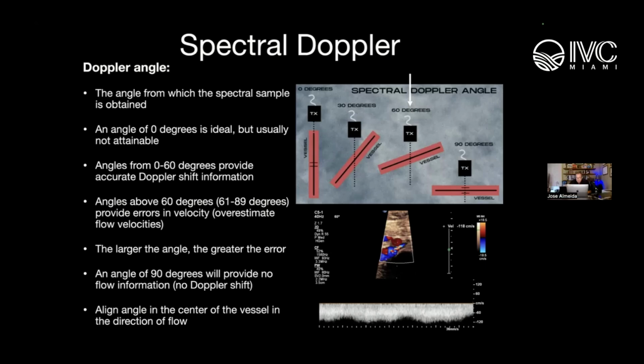But you made a great point too, that if the scale was brought to 120 to encompass the velocity. If that scale was 50, it would be wrapping around and you'd have a complete mess of your spectral Doppler information.